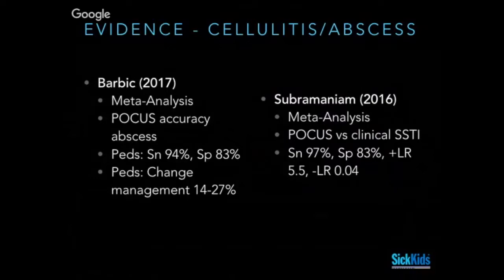and so he was going to incise it, and it was clinically an abscess, and he had him in the back procedure room where there's no monitors, and thought, come on, I'm a clinical ultrasound guy, maybe I'll get cool images. And so just for interest's sake, he took a look, and it was this hugely pulsatile femoral artery pseudoaneurysm that he was about to jab a needle into. And it's one of those images you look at and you just go, oh God. We all would have been burned clinically by it. So certainly a good idea. Think of that.